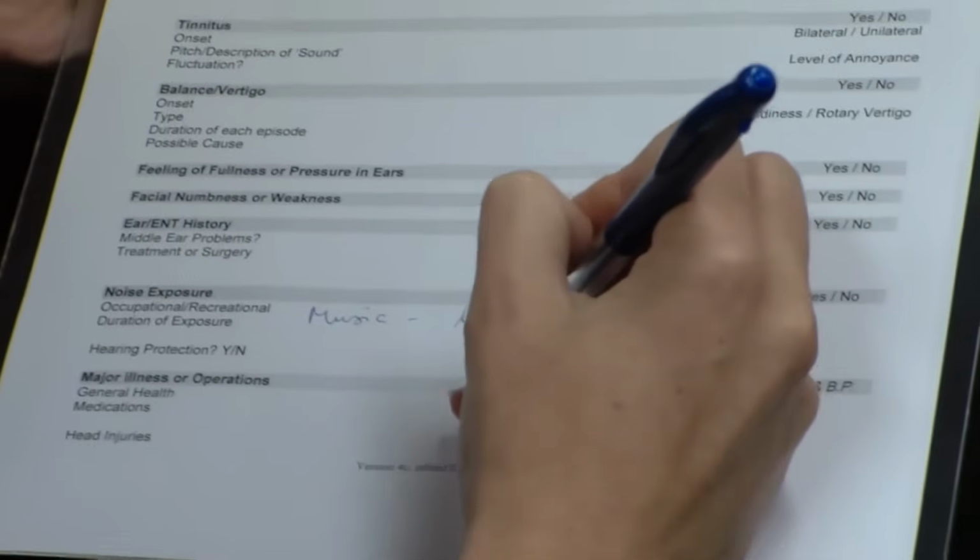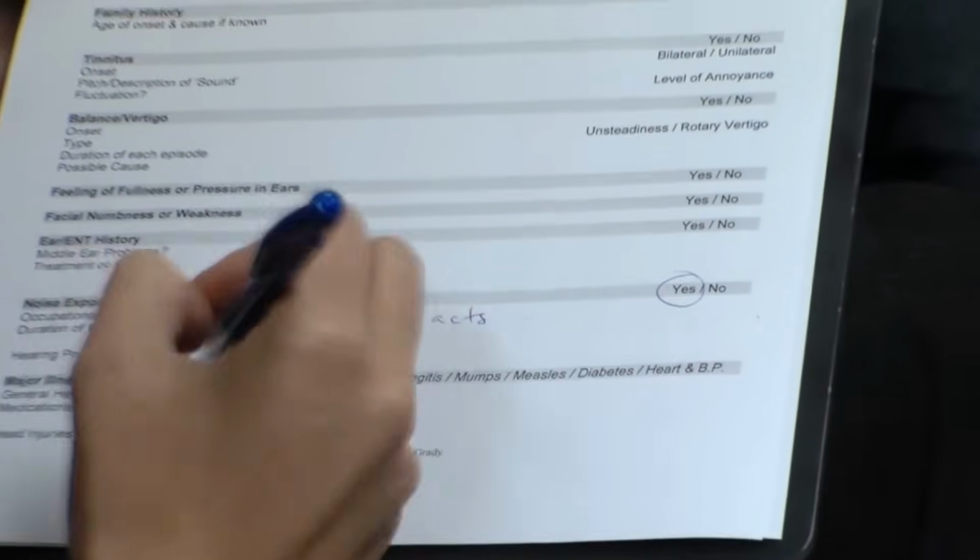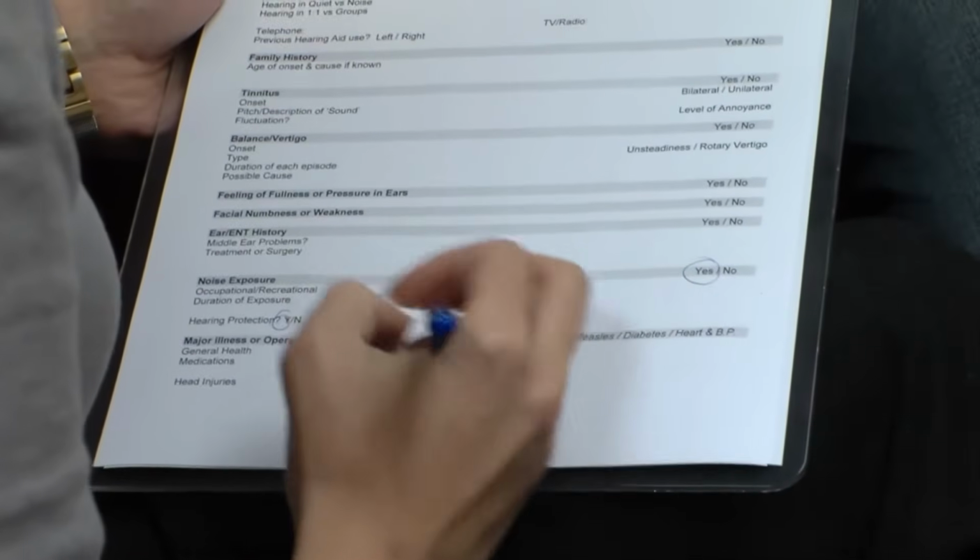The audiologist's first step is taking a detailed case history. Okay, and how long has that been going on for? Probably about 6 months to a year. The history allows the audiologist to elicit information about the patient's main concerns, their hearing and balance history, and other relevant medical background information.